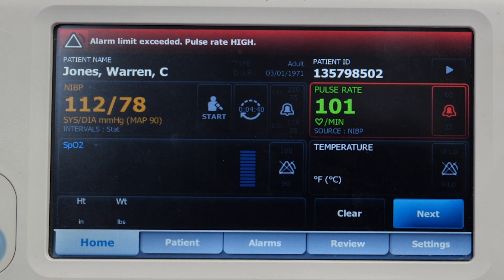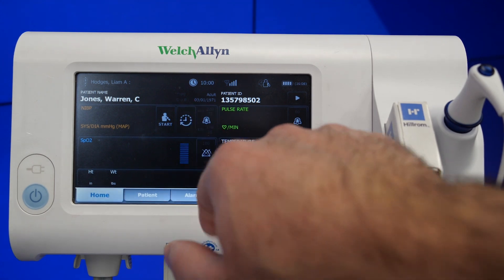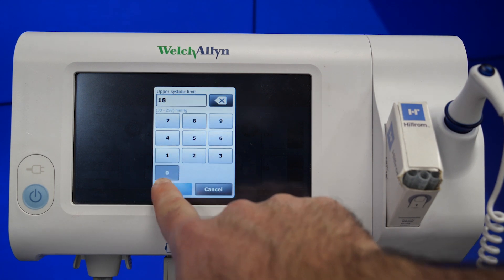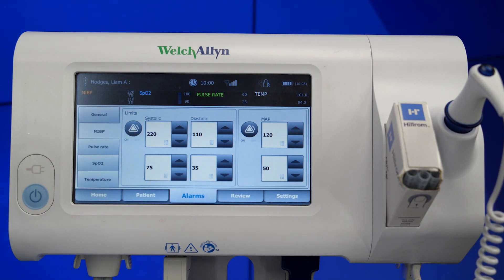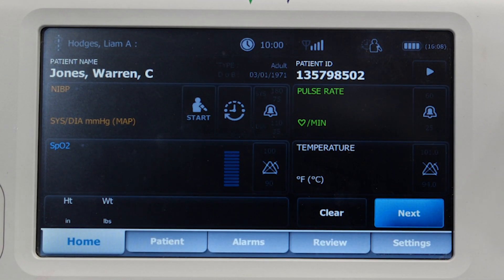Within intervals, there are alarms for measurements that fall outside of a specified range. If you want to change NIBP alarms, begin by selecting the alarm icon in the tile. Then enter the desired upper and lower alarm limits for systolic, diastolic, and MAP readings using the up-down arrows or the keypad. When you are finished, touch the home tab and you'll see the alarm settings displayed in the alarm control on the main screen.